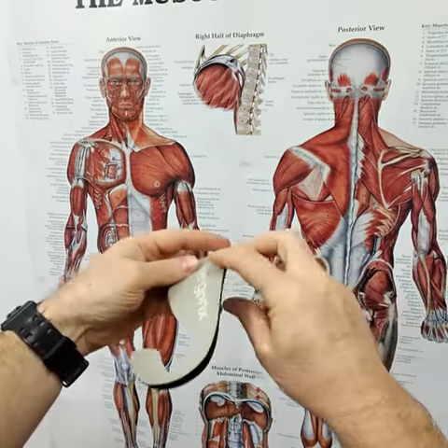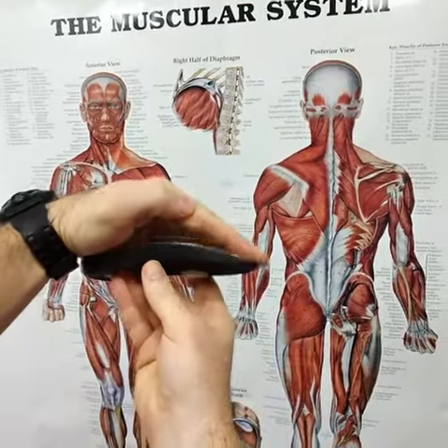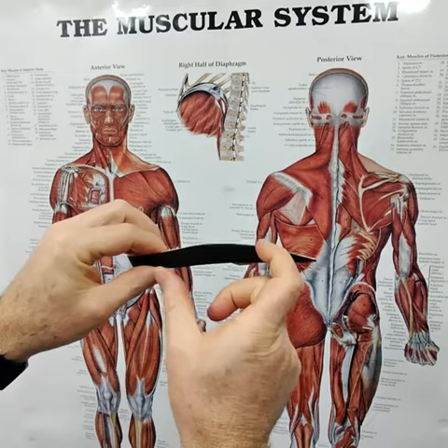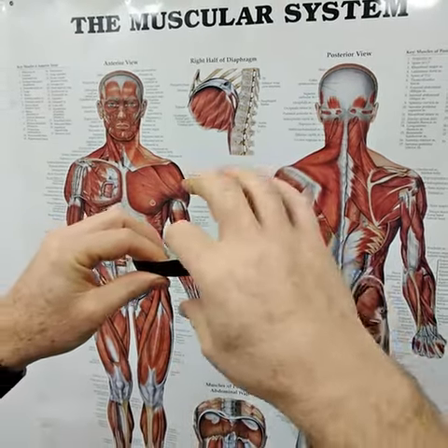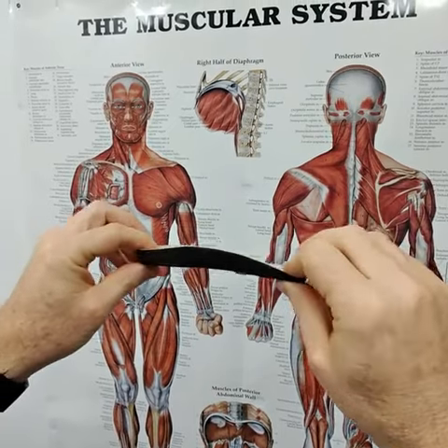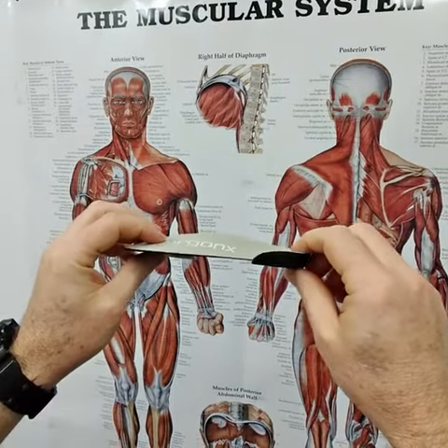The main benefit of this orthotic is its long high medial arch support. What this does is it helps to raise the arch up and limit the pressure on the plantar fascia and the medial arch. This helps to rest all the structures down the inside of the foot and helps it to heal, so you'll have less pain during the work day.